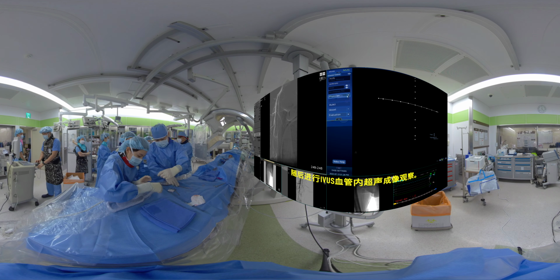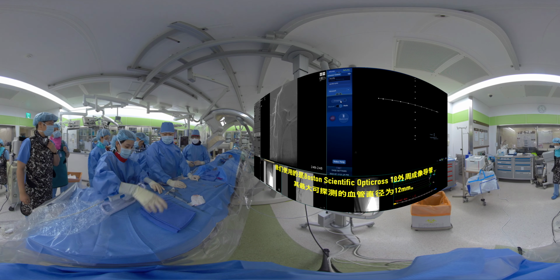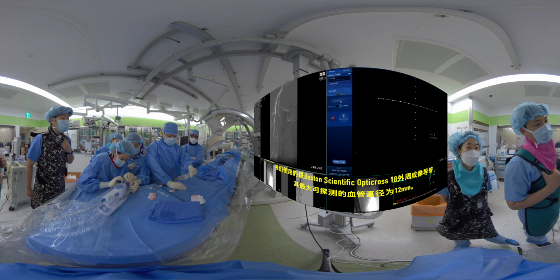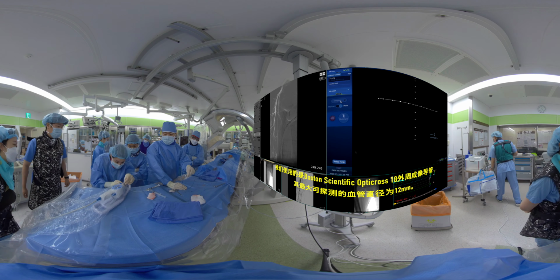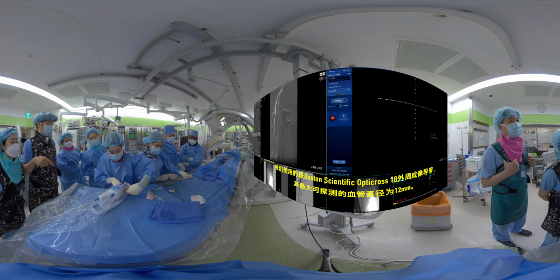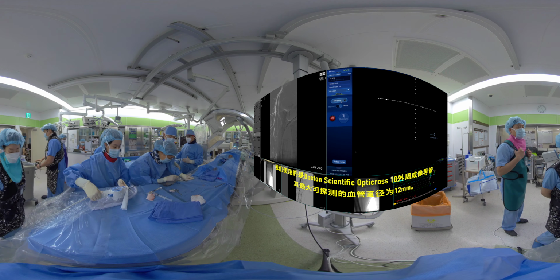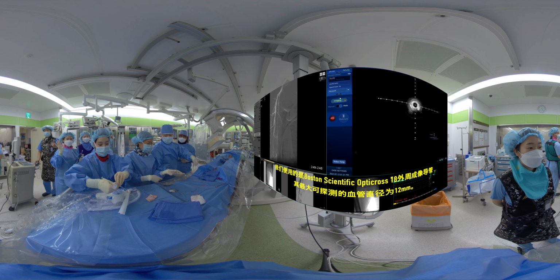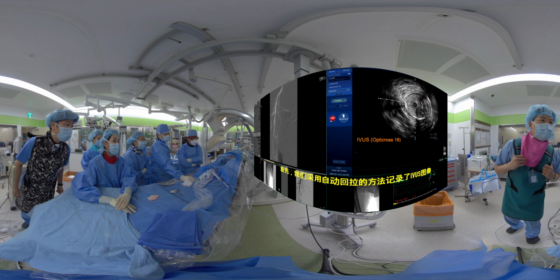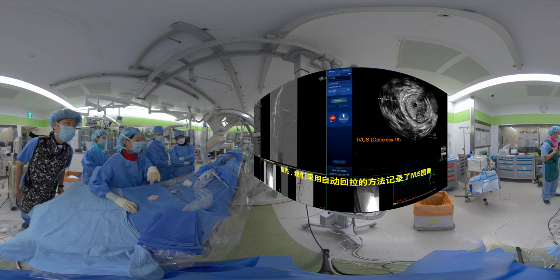Then IVUS was performed. We used the OptiCross 18 peripheral imaging catheter from Boston Scientific, which can see a maximum vessel diameter of 12 mm. Initially, we recorded the IVUS image by the automatic pullback method.